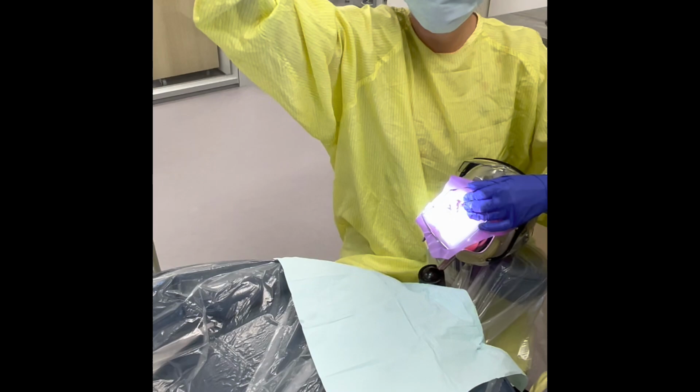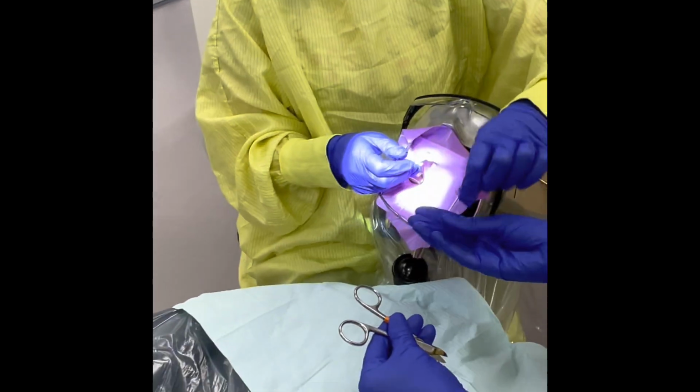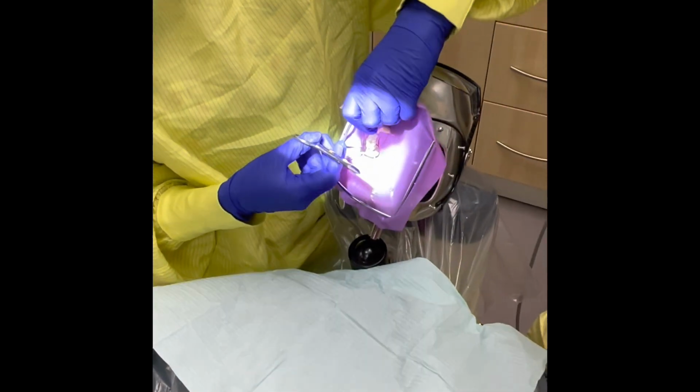to do is take out their floss or their ligature. I'll pass that to Stacy. I'm going to take my scissors and I'm going to cut my septa.